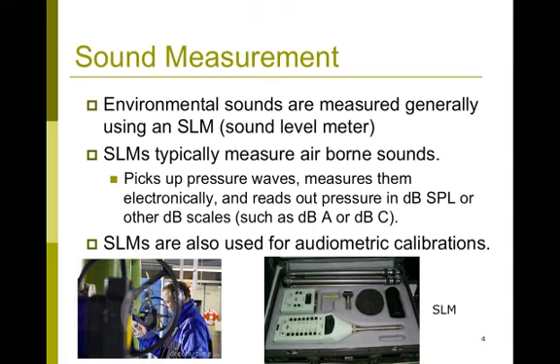Environmental sounds are measured with specific calibrated equipment. Well, typically they are sound level meters. So sound level meters are equipped with pressure microphones that measure airborne sounds, and they report to us in terms of dB sound pressure level, or you might prefer to record sounds in other dB scales such as the dBA or C. Sound level meters are also used for audiometric calibrations.